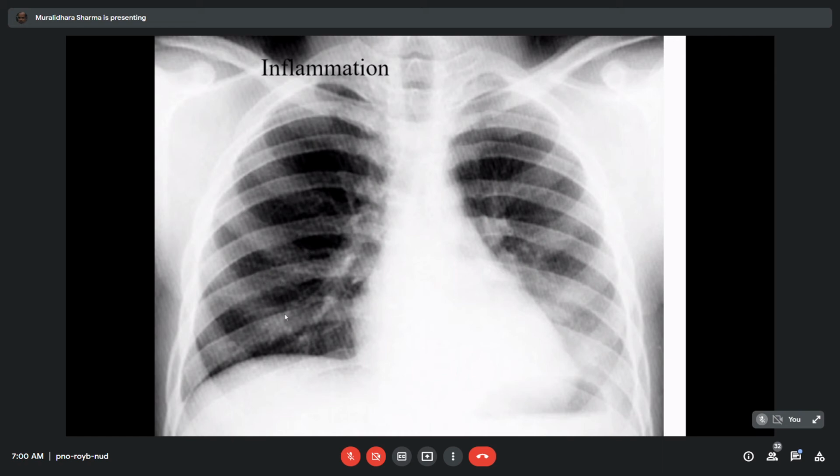This whitish dot-like appearance is named mottling in our technical term. Mottling is something like seeds thrown over the area, and you can see some spots of that. These spots are more in the lower lobe in the fifth segment, whereas the fourth segment has some amount of that. The superior area, the apex area and the middle lobe area, are free.